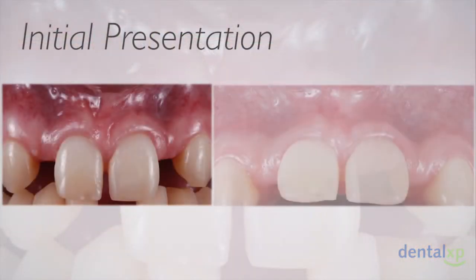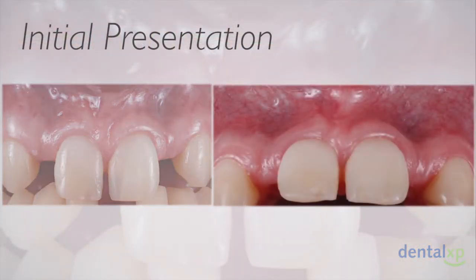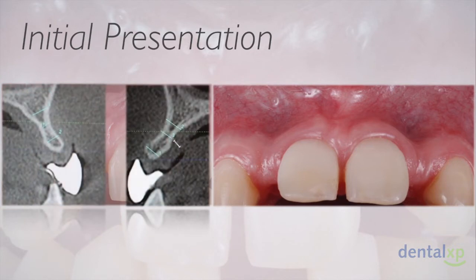So clinically and radiographically, you could appreciate the ridge deficiencies he presented with as a result of the agenesis of his lateral incisors. So again, we had two very similar defects in the same patient, and in this case, we opted to go for a demineralized trabecular bone sponge graft for the right side and an autogenous chin graft for the left side.